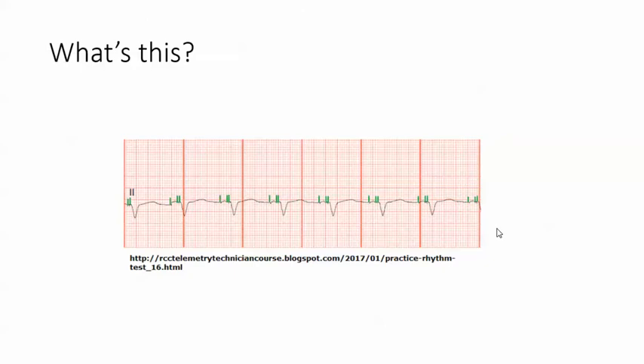So what do you think this is? Look at it closely. The spike here is coming before a P wave, so that's atrial pacing. And these two spikes are coming before the QRS — that's biventricular pacing. So you would call this AV paced biventricular pacing.